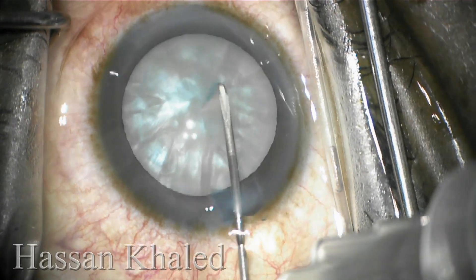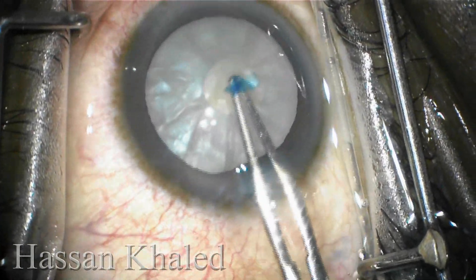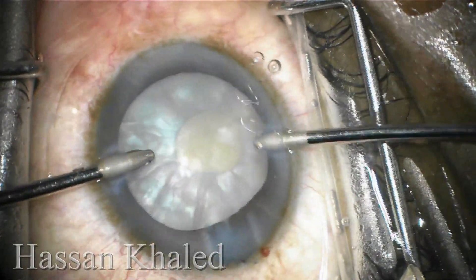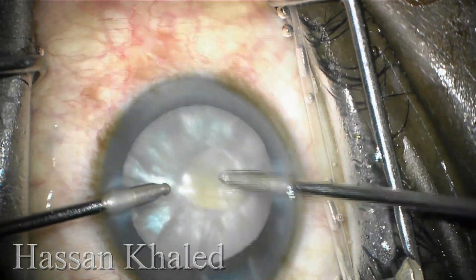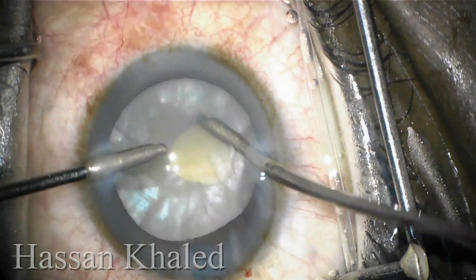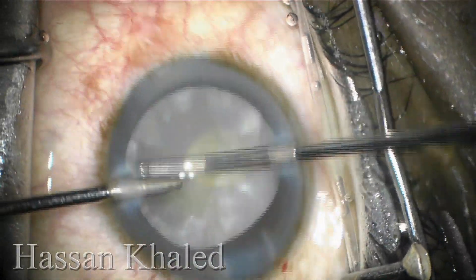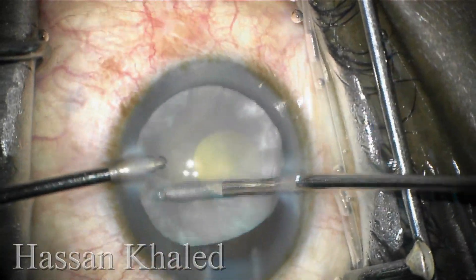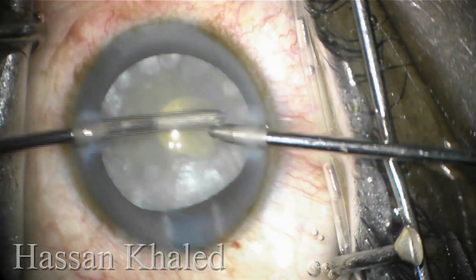Then I'm going to do the double capsulorhexis technique in this intumescent cataract. To avoid the incidence of the Argentina flag sign, it's very important to decompress the intralenticular pressure using bimanual irrigation aspiration, or you can use a cannula connected to a 5 cc syringe.